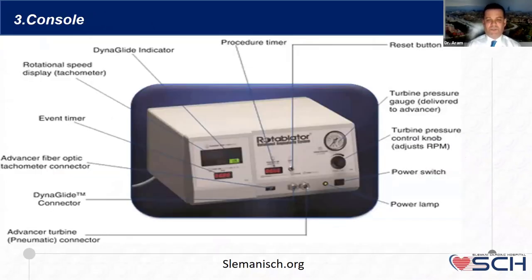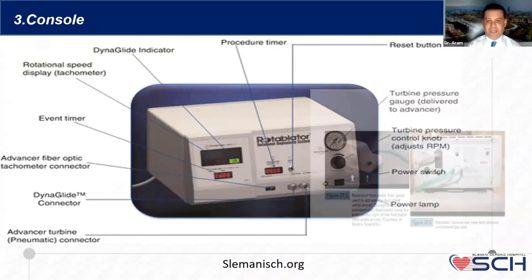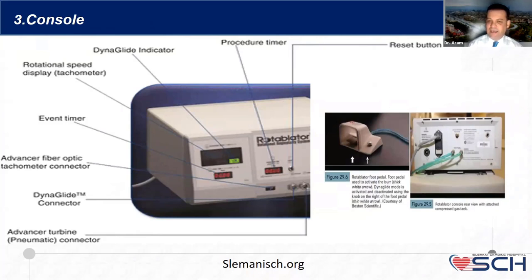The other part is the console. The console is the hardware of the rotablator, because all parts will be attached to this console. I don't want to go into the detail, and that's the pedal part. The pedal foot switch will be attached to the back side. But in the new version, as I said, this is only done by hand.